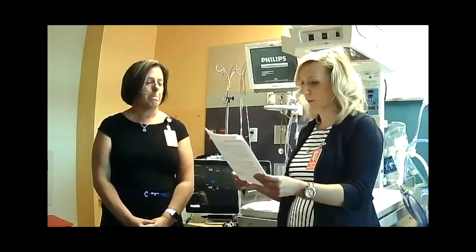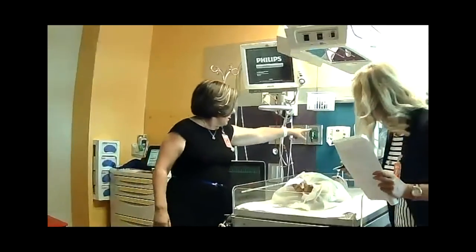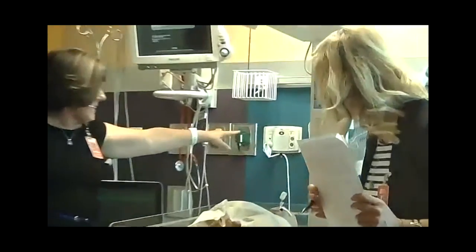Excellent. Do you have time for one more question? One more question is rapid response. What is it and how do I use it? Okay. Well, there's two kinds of rapid response. In the cardiac ICU, you'll see here something maybe called staff assist. So a staff assist is actually these buttons here, right there. I don't know if you can see, there's a code button, a staff assist button.